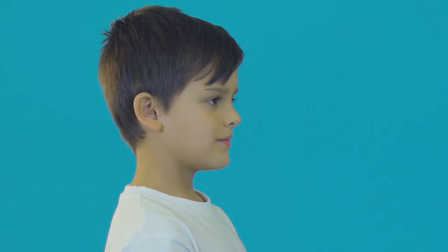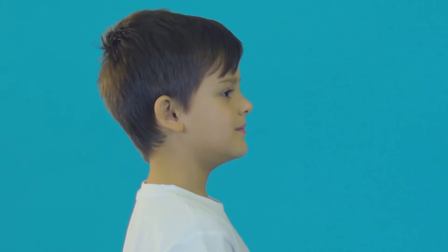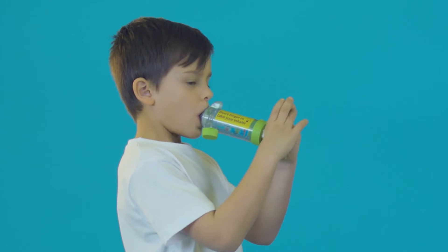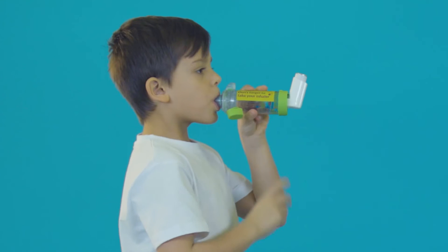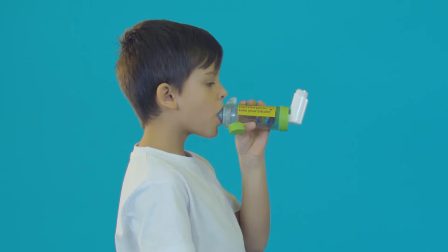Ask your child to sit or stand up straight and slightly tilt their chin up, as it helps the medicine reach their lungs. Ask them to put their lips around the mouthpiece of the spacer to make a tight seal and begin breathing in and out. Press the canister on the inhaler once and encourage them to breathe in and out slowly and steadily into the spacer five times.